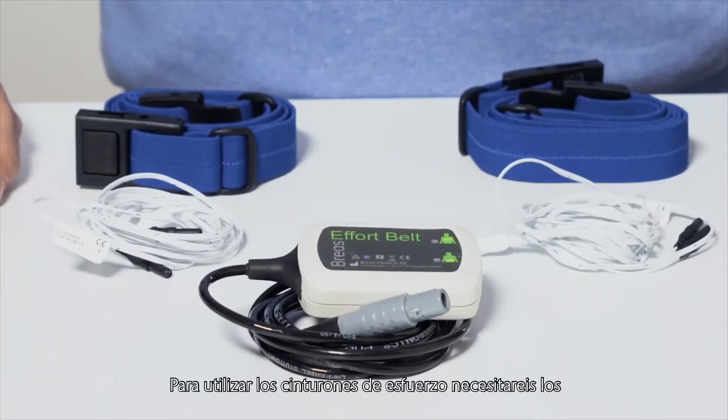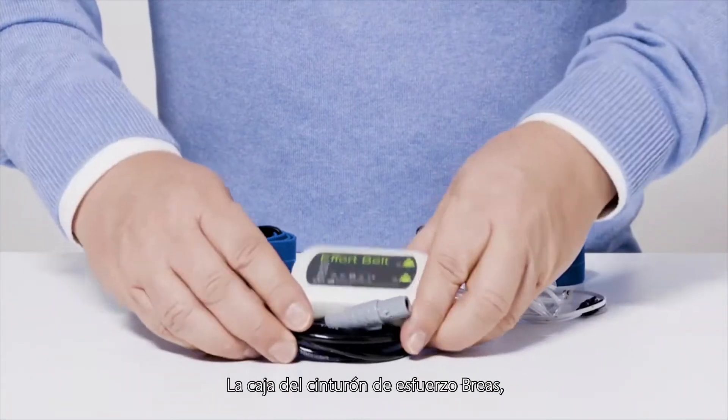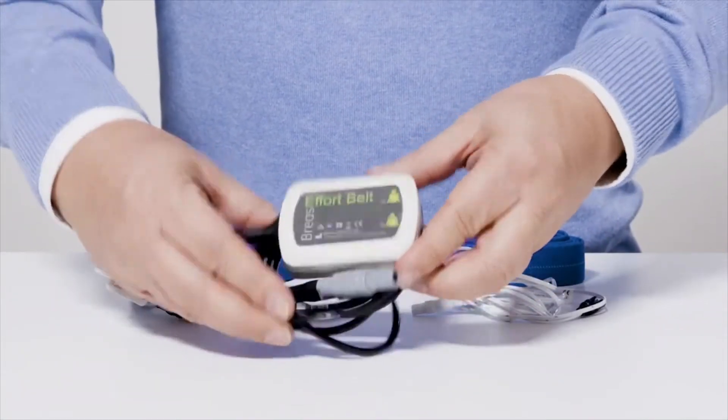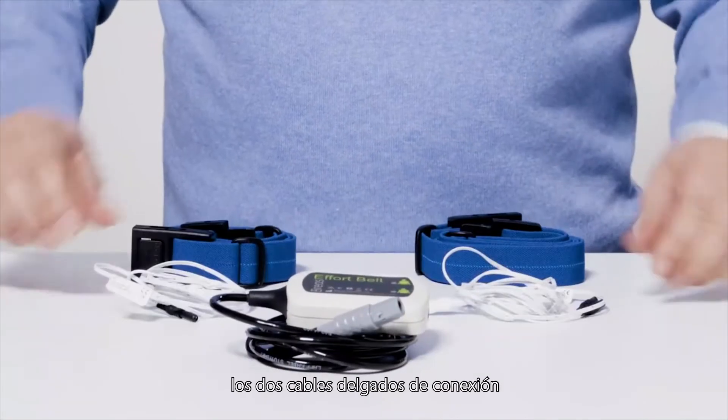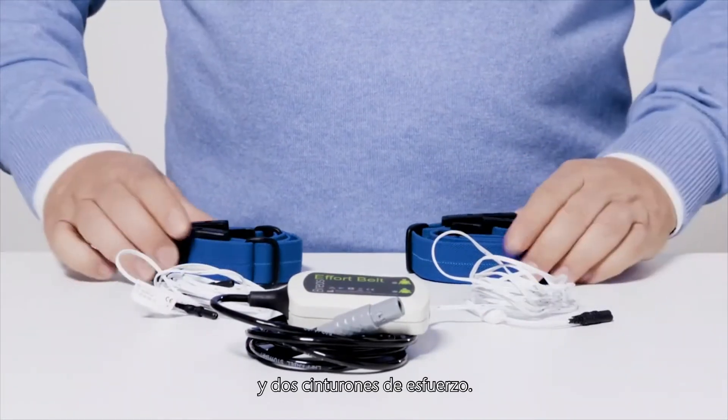To use the effort belts you will need the following items: the BreaS effort belt box, the two thin white connection wires, and two effort belts.